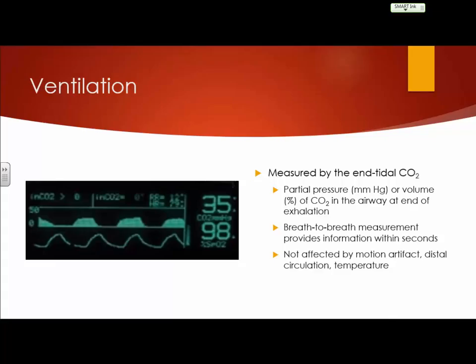But when we're measuring ventilation and we're measuring the end-tidal CO2, there's not a lot that can really skew that reading other than maybe placement and equipment malfunction, all right? Because we're placing that right on the source. We're sampling the expired air. We're sampling the breathing. So these numbers are coming from the source. All right?